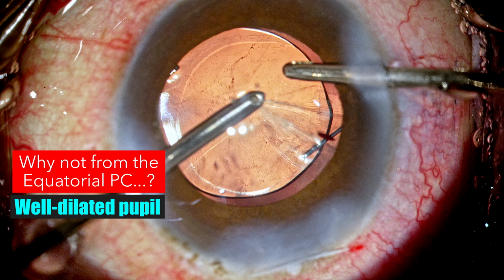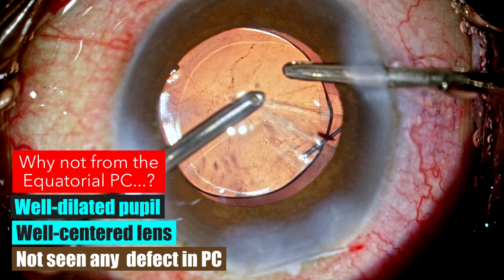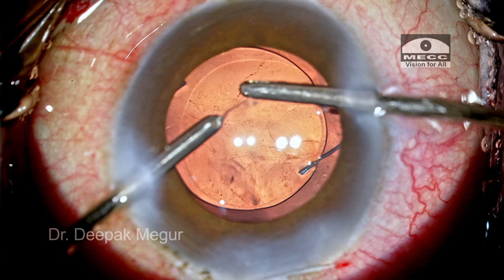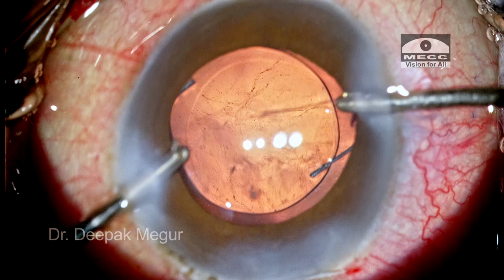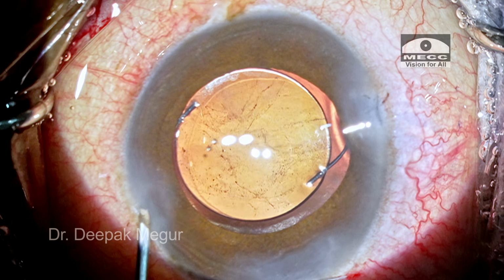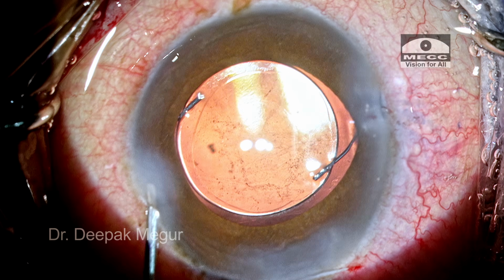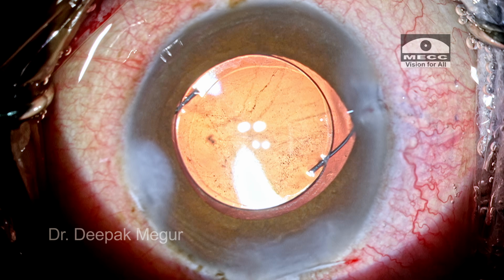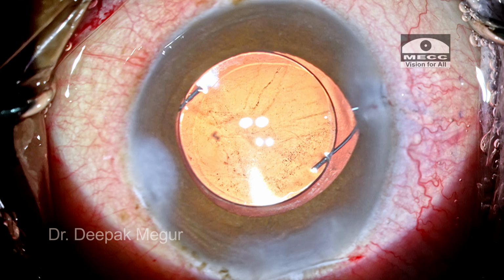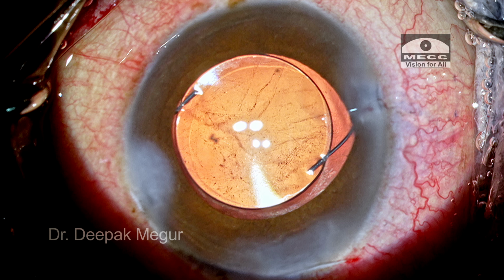I can see the pupil is very well dilated, the lens is well centered, and I am unable to see any defect in the posterior capsule as of now. Although considering an equatorial PC tear in the differential diagnosis is wise and should always be looked for, in this case, because of the absence of any visible tear in the equatorial region of the posterior capsule and the lens being very well centered, which wouldn't have been the case if the PC tear was in the same region as the haptic, this would suggest that we are dealing with a transzonular prolapse of the vitreous.